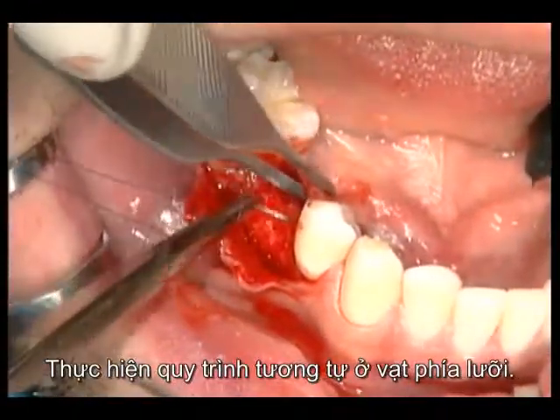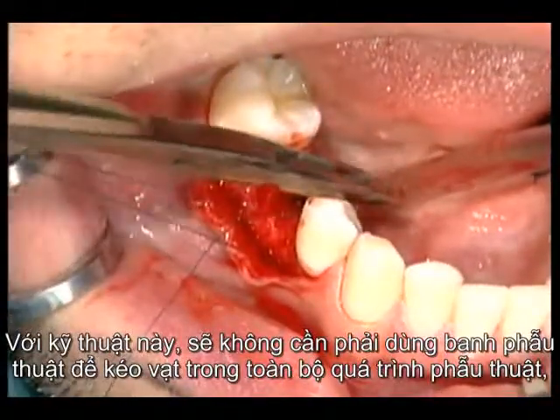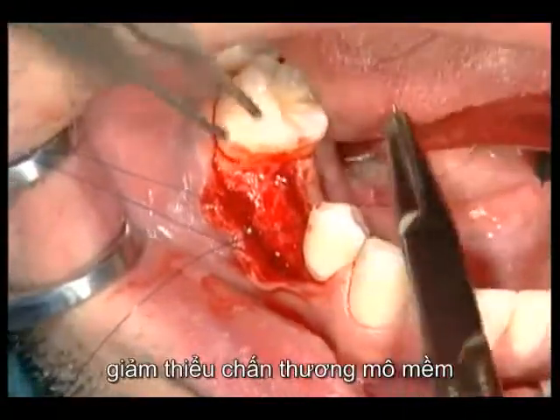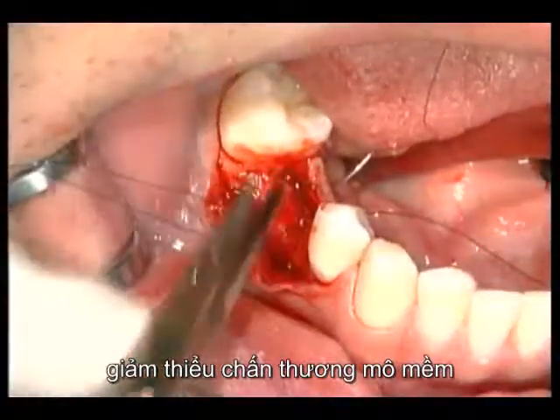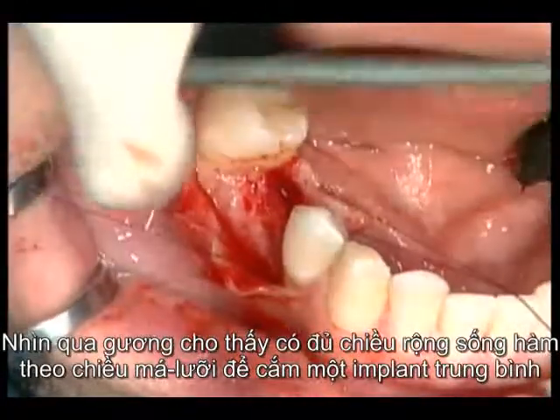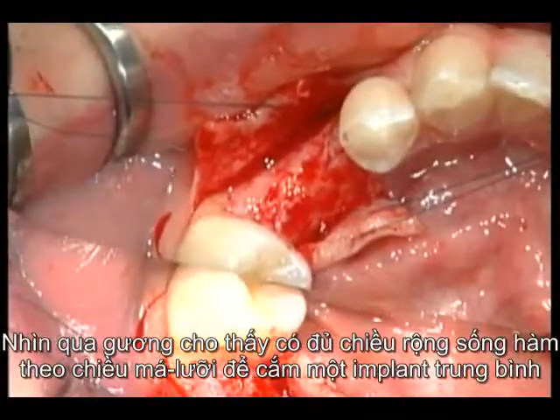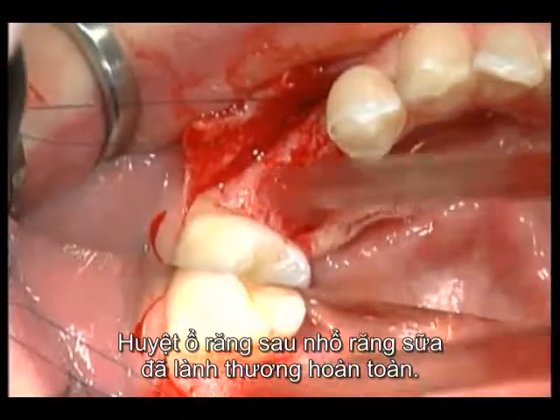The same procedure is carried out lingually. With this technique, no surgical retractors need be used inside the flap during the entire surgery, minimizing trauma to the soft tissues. The mirror view demonstrates sufficient orofacial crest width for the insertion of a standard screw. The extraction socket of the baby tooth is fully healed.